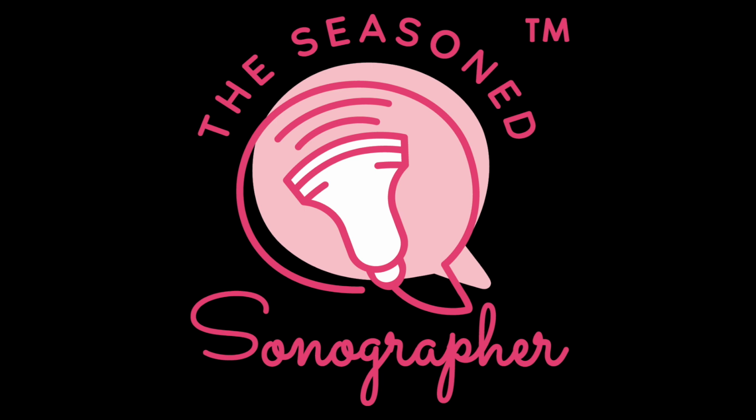Some of the indications for performing a first trimester ultrasound are obviously dating, confirming the intrauterine pregnancy and viability, and ruling out any ectopic. If the patient's had bleeding or pain, you want to get a first trimester ultrasound and see what's going on there.